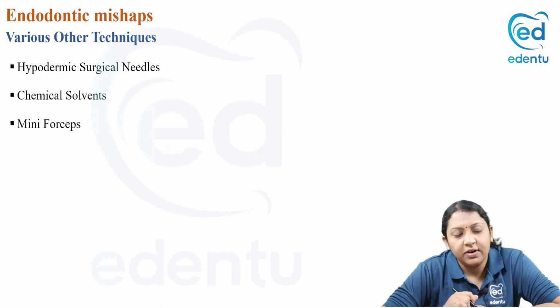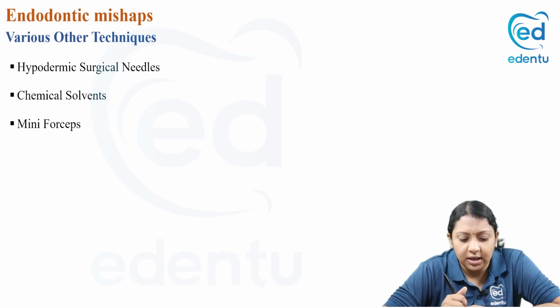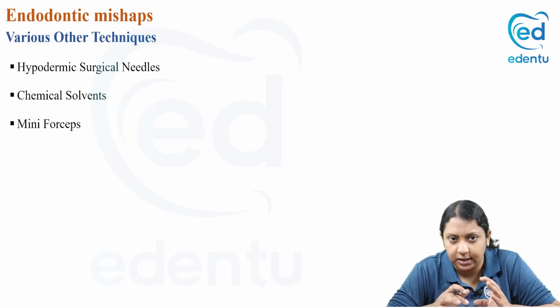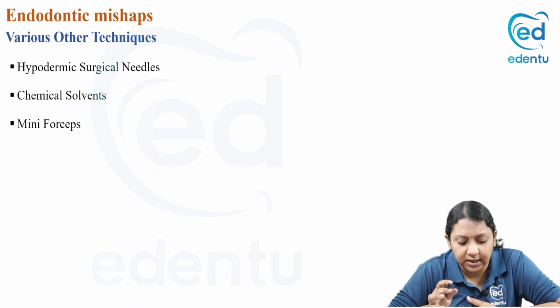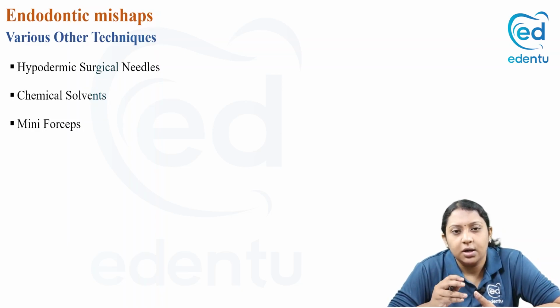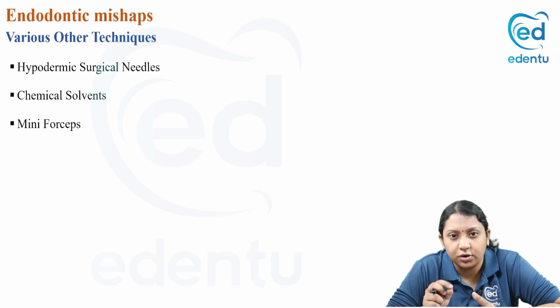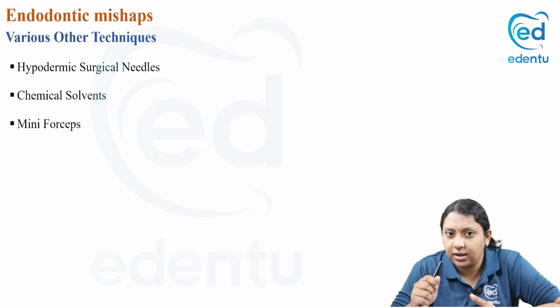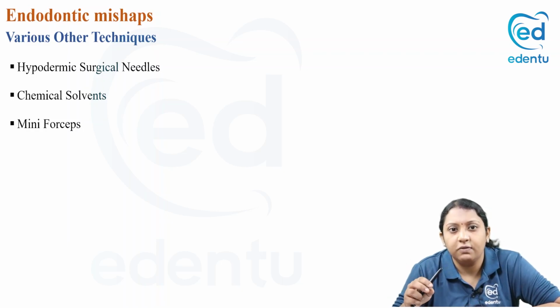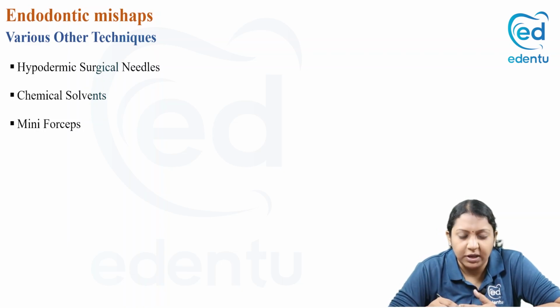There are various techniques for instrument retrieval, and we have to know the names mainly. Hypodermic surgical needles, chemical solvents, mini forceps. The mini forceps, as the name suggests, is a forceps, so we cannot engage it up to the apical third of the canal. We can only retrieve the instrument using a mini forceps if it is loosely bound, and if it is in the coronal third.